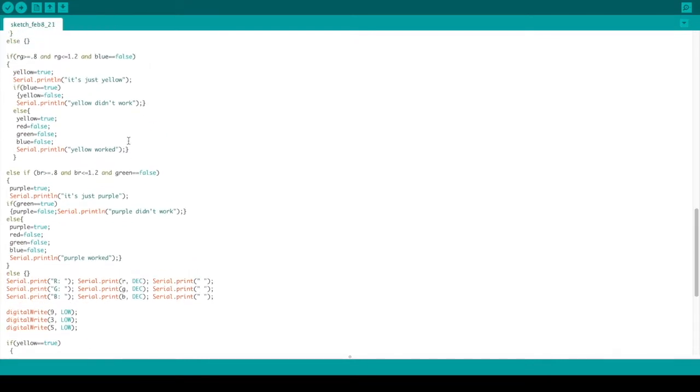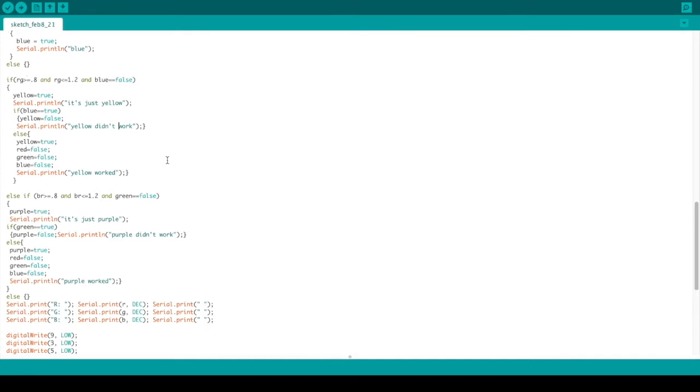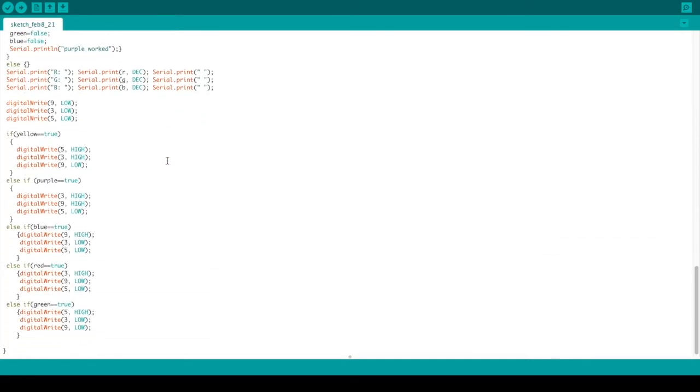Then to make sure if it's a secondary color, we will determine whether the ratio of red to green is within 20%. And if that's true and blue is also false, then we set yellow to be true. And that ratio of 20% we determined by trial and error. That's what most people would call that secondary color instead of just being red or green. And we do this for the other two secondary colors as well. Then once we know what the color is, the Arduino will send a signal to the vibration motors on the back, which will let the person know what color is in front of the light sensor.